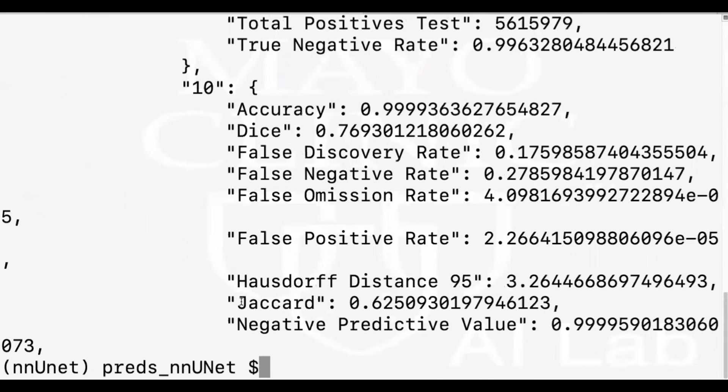So I also show you the last 50 lines of this.